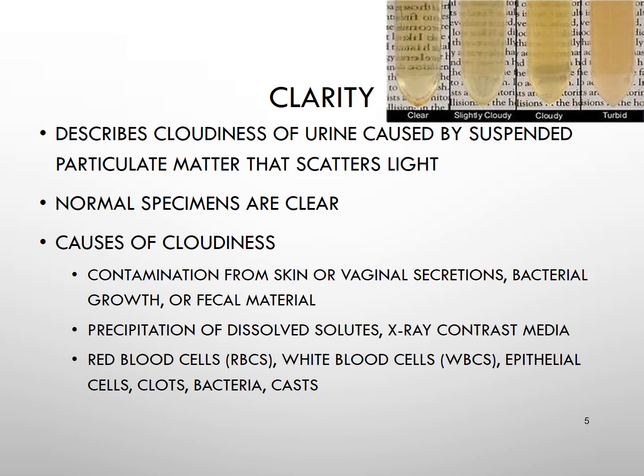see with the urine. Now hazy or slightly cloudy, you see visible particles present, but you can read through newsprint when viewed through the urine tube. Now clarity varies here with the substances and the amount present, so you could see a small number of contaminants or white or red blood cells.